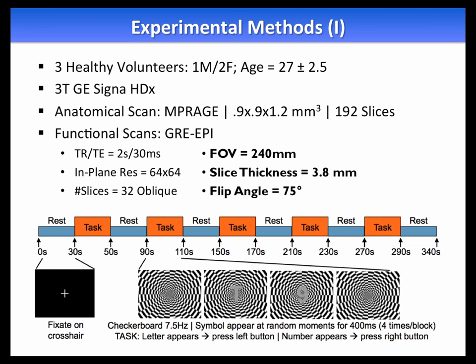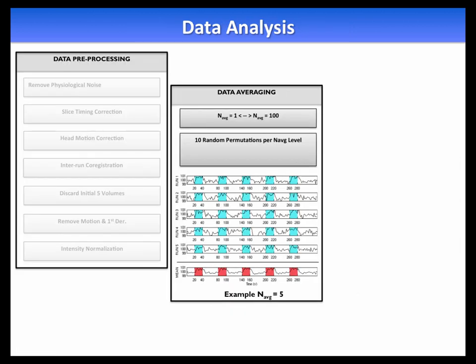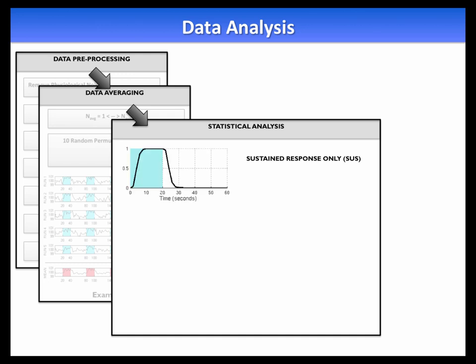He averaged for 9 hours and did a block design, a very simple task of tapping their fingers when they saw either a number or a letter, just to keep their attention. And like I said, he averaged like crazy. And he did one other thing too. He didn't confine it to having a simple model.